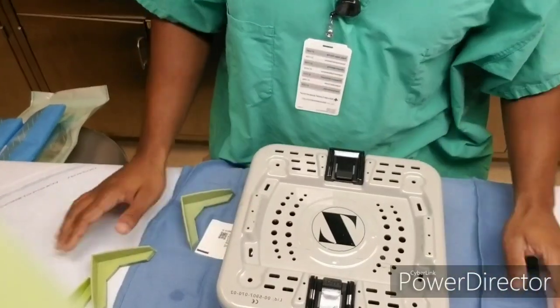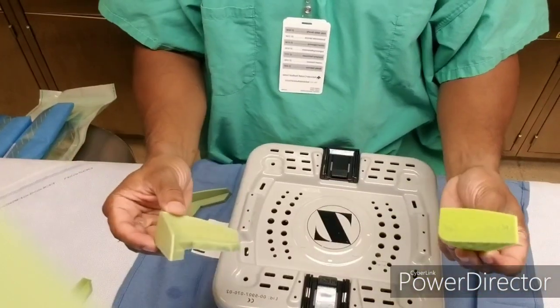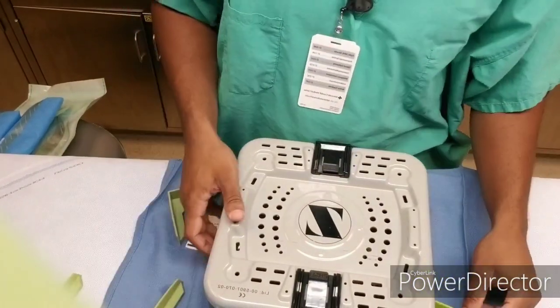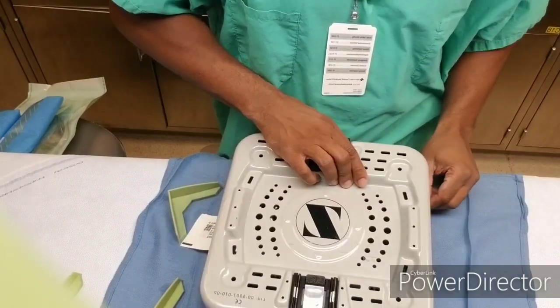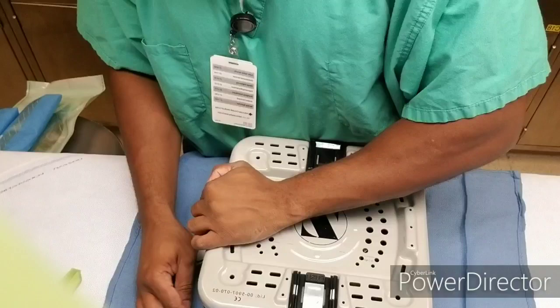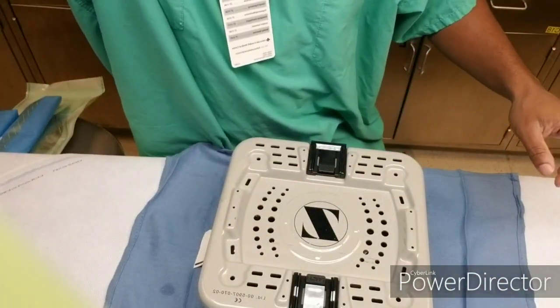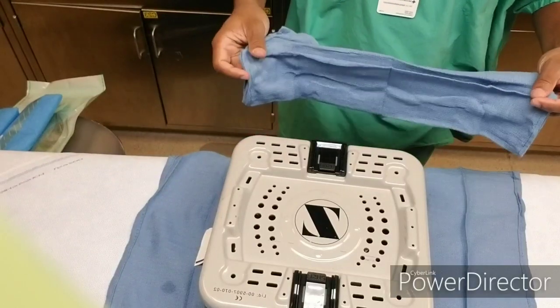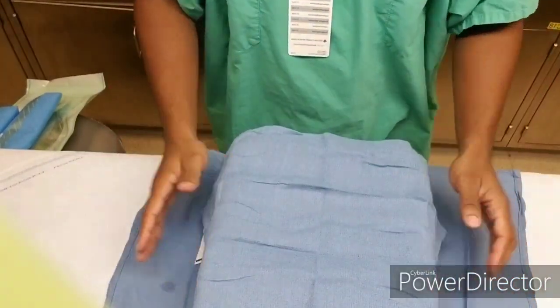YouTube, this is your boy TheTravelingBeard back with another quick vid. Today I wanted to touch on wrapping instrument trays for sterile processing. Wrapping instrument trays for sterile processing is an important aspect of the job. You must know how to wrap. I don't see many videos on it.